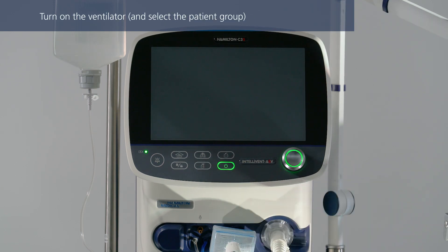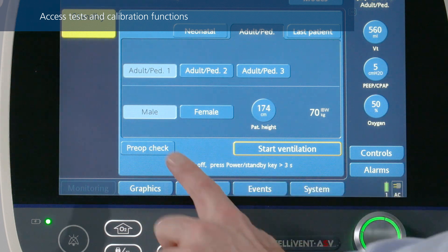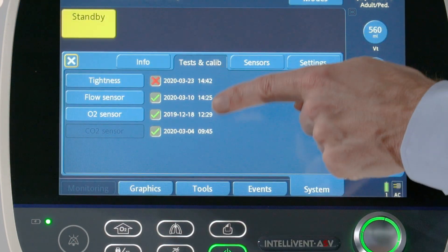Turn on the ventilator. The ventilator runs a self-test. When that is complete, select the correct patient group. To access tests and calibration functions, touch pre-op check or the system button in the standby window, then select the tests and calibration window.